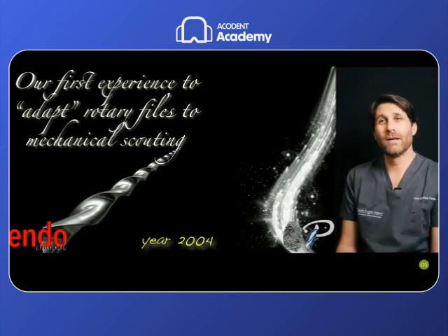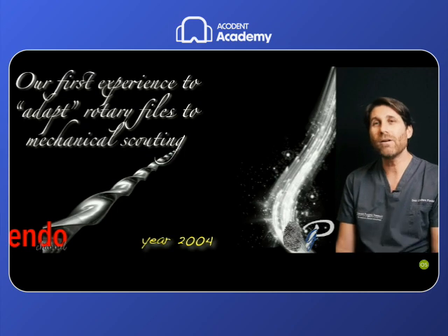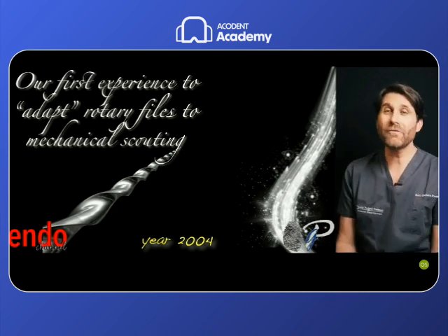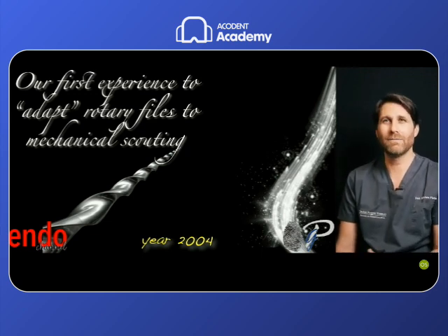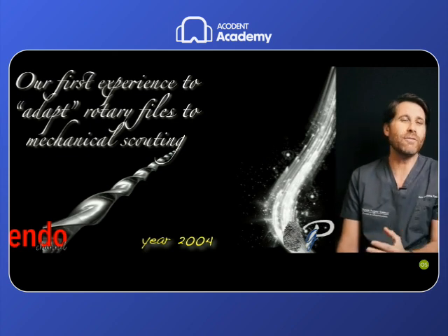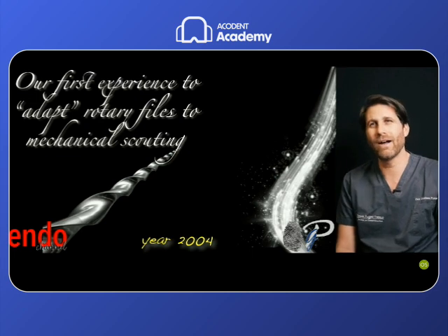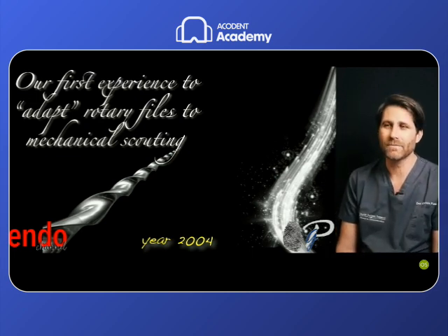As soon as the M2 files came on the market, there was for the first time ever a small file, tip size 10 taper 4, that was the first file of the sequence, but that can really be classified as a glide path scouting file because of its characteristics. It was not a file marketed for this or with the name glide path file, but it was the initial file of a sequence.